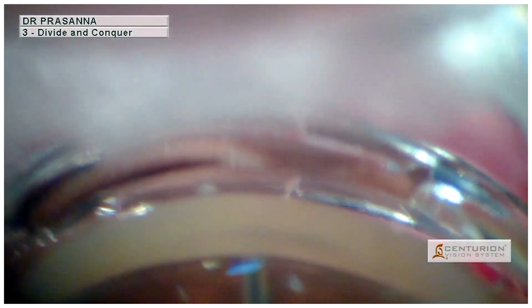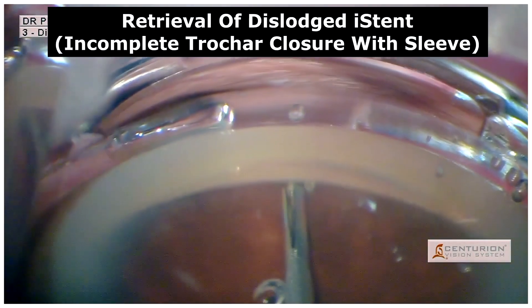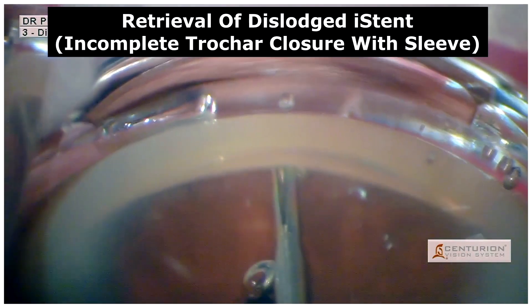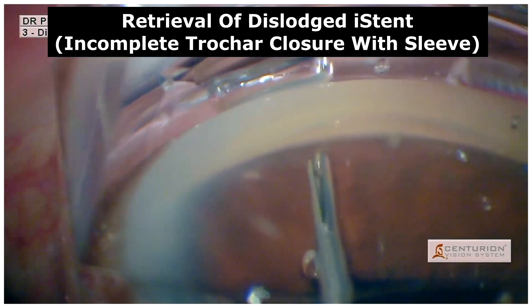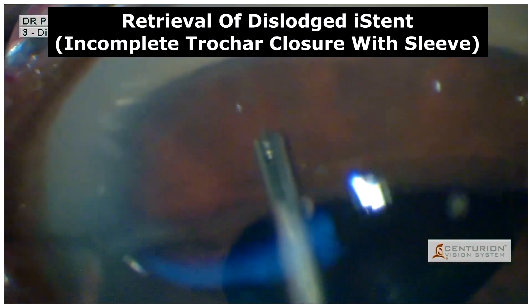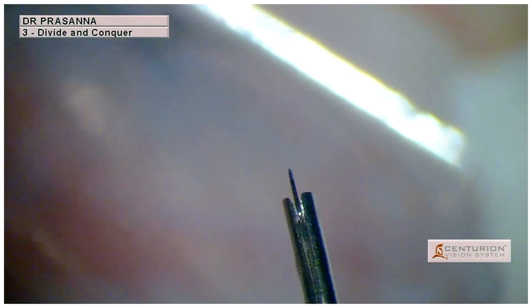Following the implantation, an iStent retrieval was done by re-threading the iStent via the trocar. But as the sleeve of the trocar was not completely closed when removing it out of the wound, the iStent was lost. As we can see here, it is an empty trocar without the iStent.